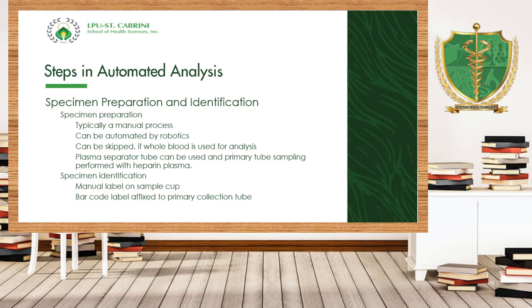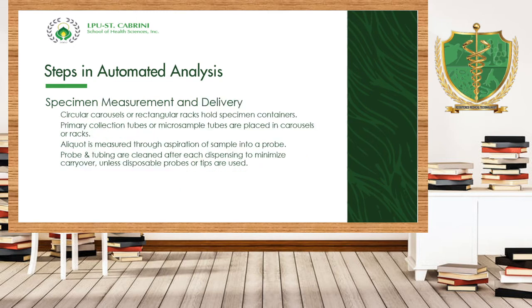And we have another technique, using the laboratory information system. Kagaya po ng pinakita ko sa inyo sa ating synchronous session, meron po tayong barcode label. This barcode includes the demographics of the patient, okay? The test to be done for the patient, at saka kung ano po yung mga details, no? Diagnosis ni patient. So, mas madali na. Our machine, i-read na lang yung barcode. Meron pong mga barcode scanner yung mga machine para malaman kung ano yung test na gagawin.